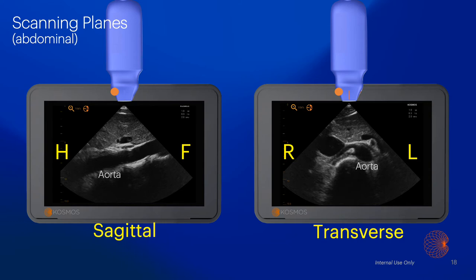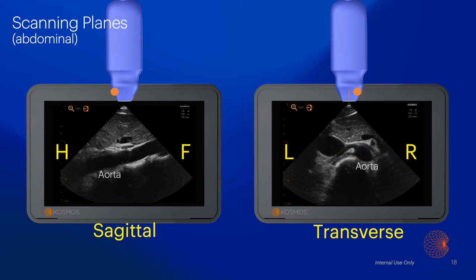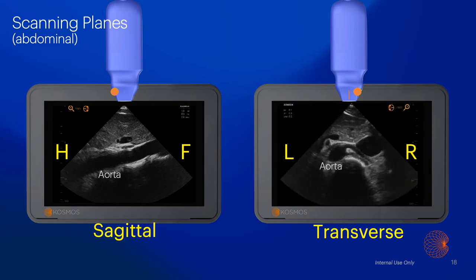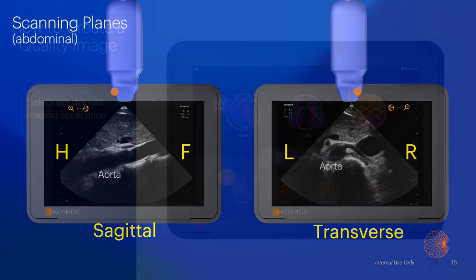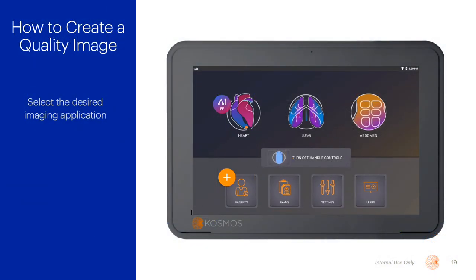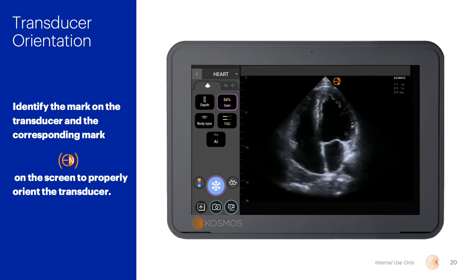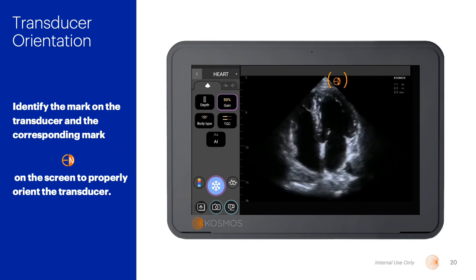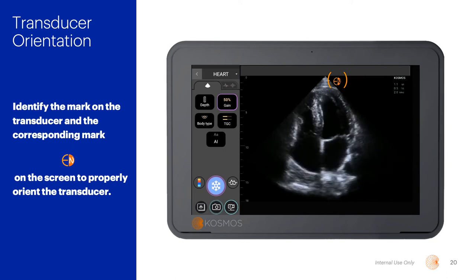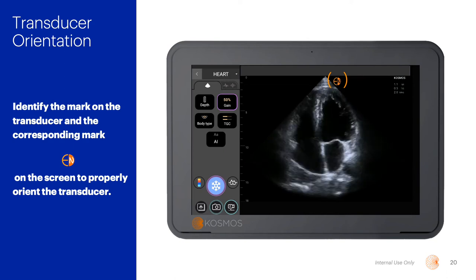If we incorrectly rotate the transducer so the orange dot is pointed toward the patient's left side, our right-to-left orientation is now reversed, and our displayed anatomy must also be reversed. If we select a different imaging application, it is possible our screen orientation mark may also change. In this example, when the heart application is selected, you will notice the Ekinos logo now appears on the right-hand side of the sector. This occurs by default, and we must adjust our transducer orientation accordingly to ensure a standardized view and correct anatomical orientation are maintained.